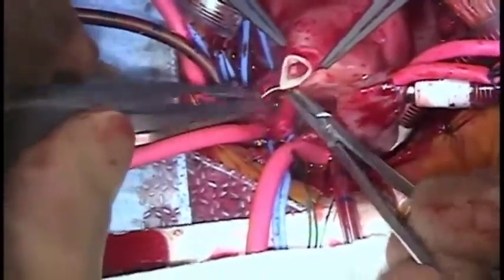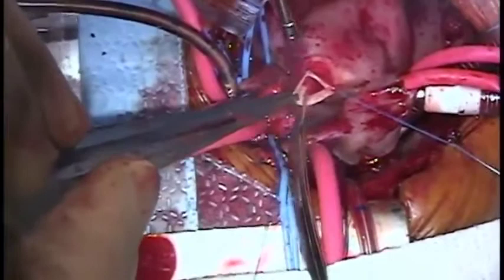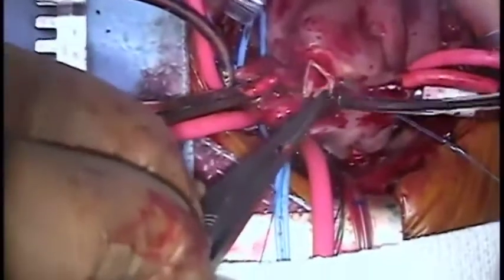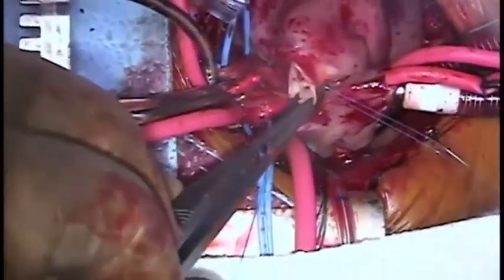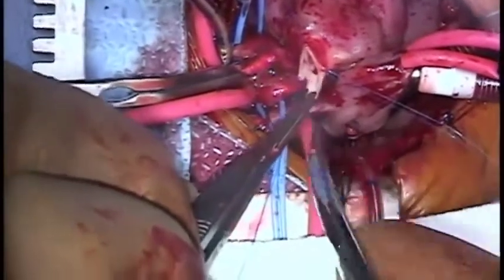Stay sutures are placed at the aortic valve commissures. After ensuring that the coronaries do not take an intramural course, they are excised from the aorta on generous buttons. Here we see the right coronary artery being excised. The stay sutures provide counter traction, allowing accurate dissection. Once the initial excision has been achieved with scissors, further mobilisation with electrocautery is carried out.